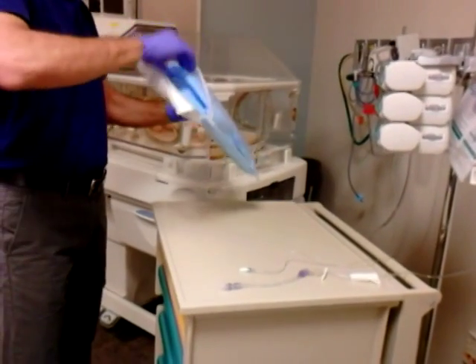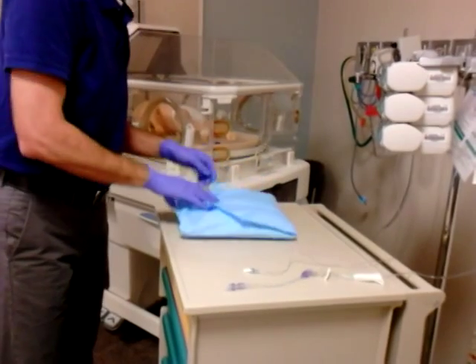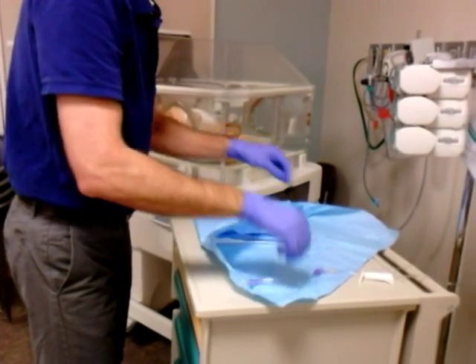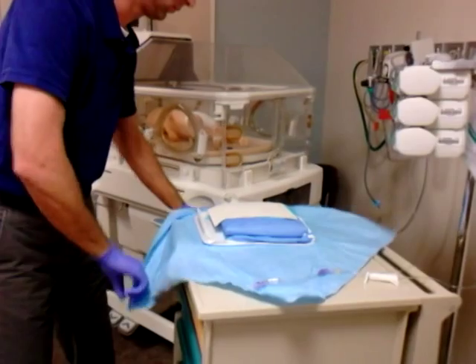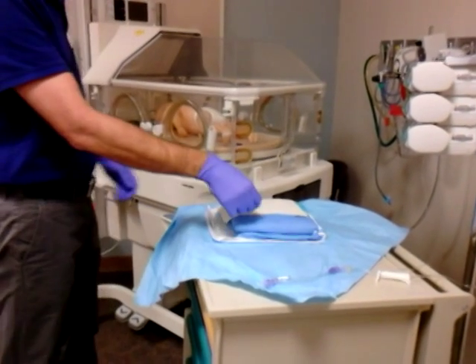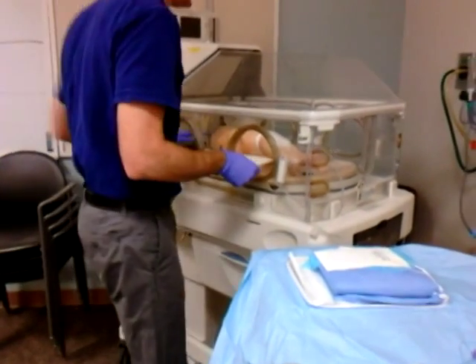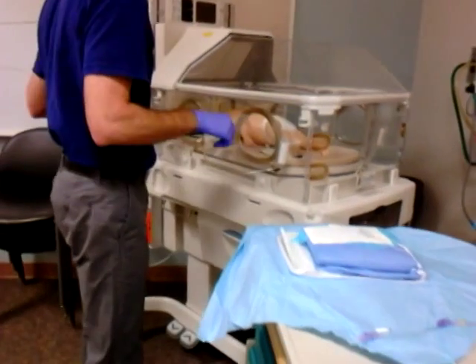Next we're going to open the line kit. We're going to take and place the sterile drape that's on top of the kit underneath the baby's current IV site and extension tubing.